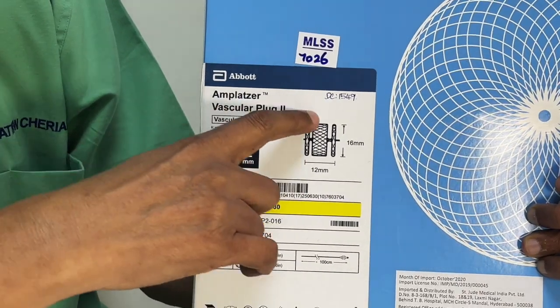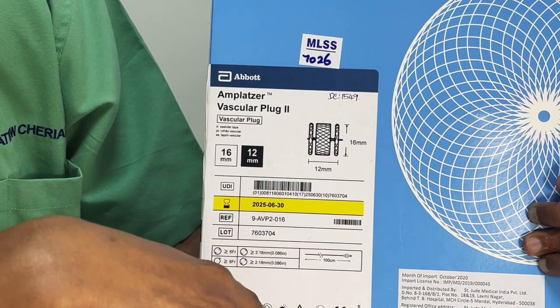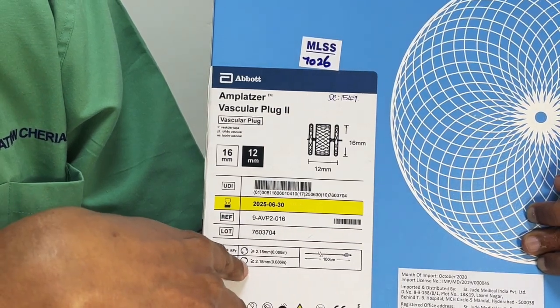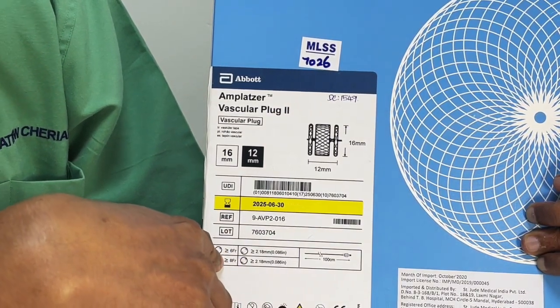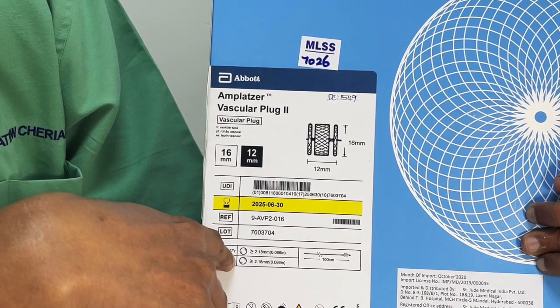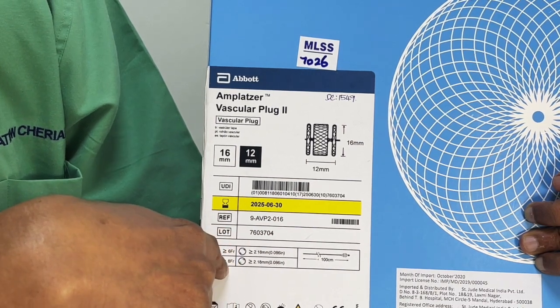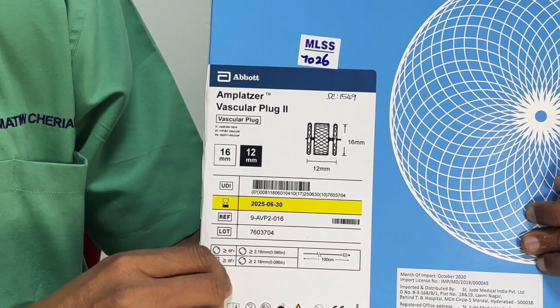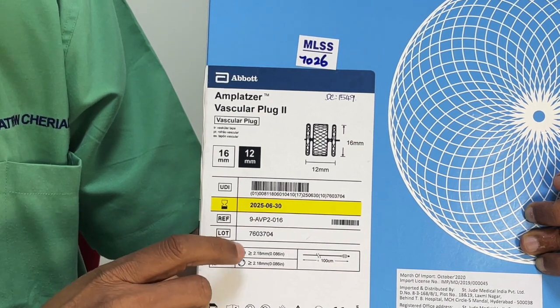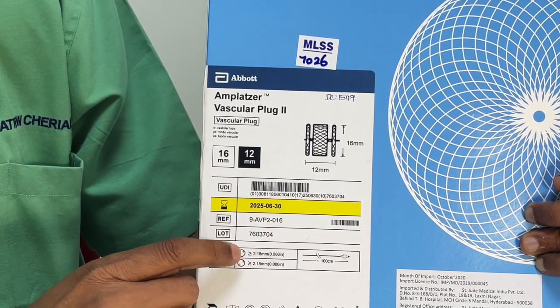But again, the large ones go through pretty large devices. So you can see the device also, they will mention very, very clearly what you're supposed to use, that the device should be equal or greater than 6 French in terms of sheath, or if it's a guiding catheter, it should be 8 French. I hope you can see it out here. So you understand, look at this. This is very important. Otherwise, it won't go through. So here it's a 6 French sheath.